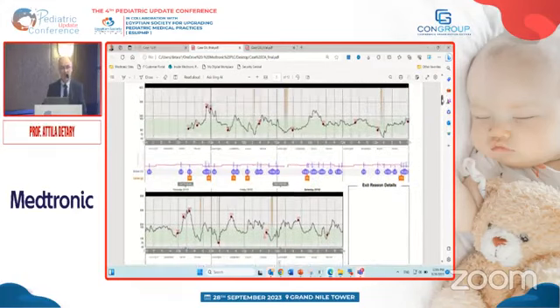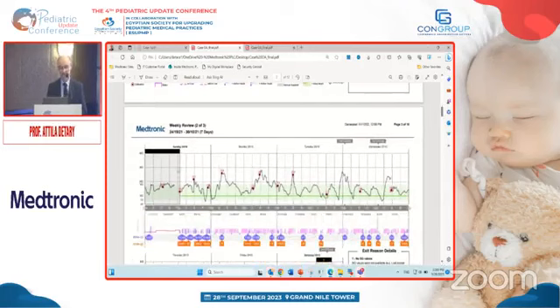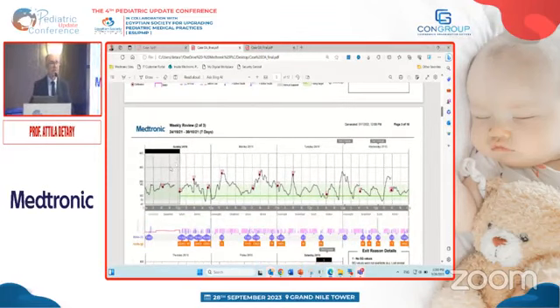So here in this report, you see a gray background and a black band on the top. And on the following one, you do not see it. It's clear. So this day is very interesting because half of the day has background, the other half of the day, no background. So what does it mean? It means that this was the switch from manual mode to auto mode.